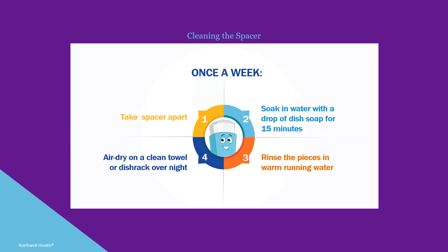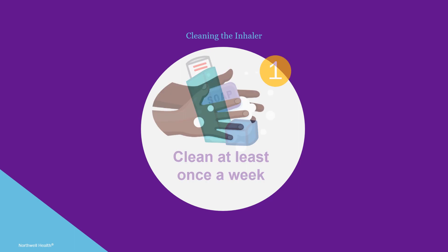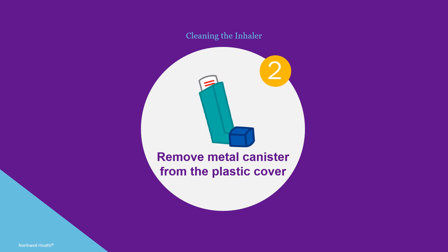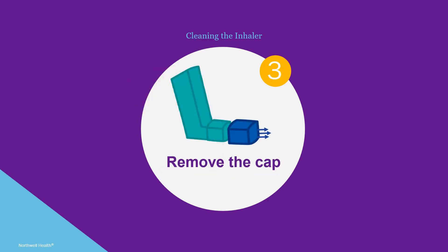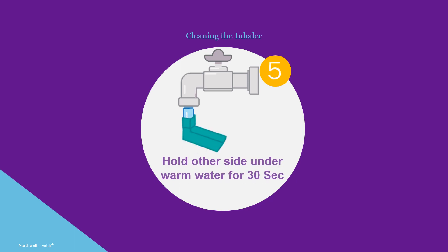It is also important to clean the inhaler once a week. First, wash your hands thoroughly. Remove the metal canister from the plastic inhaler container — do not clean or get the metal canister wet. Remove the cap from the plastic inhaler container. Hold one end under warm running water for 30 seconds, then flip the container over and hold the other end under warm running water for 30 seconds.